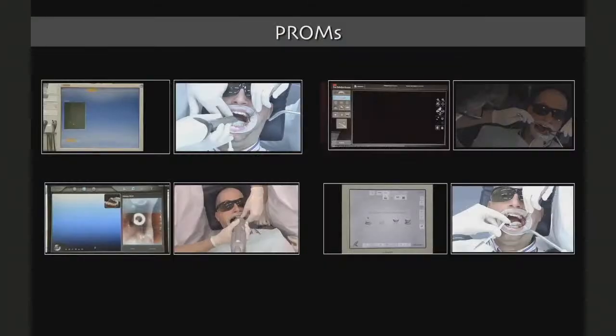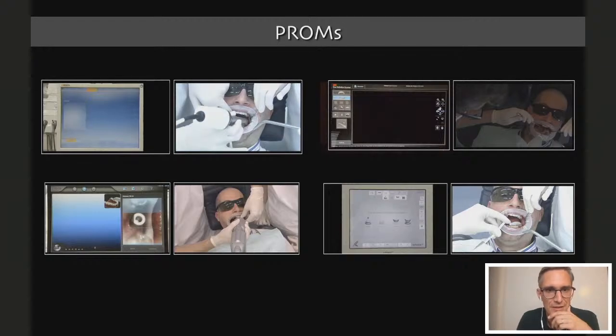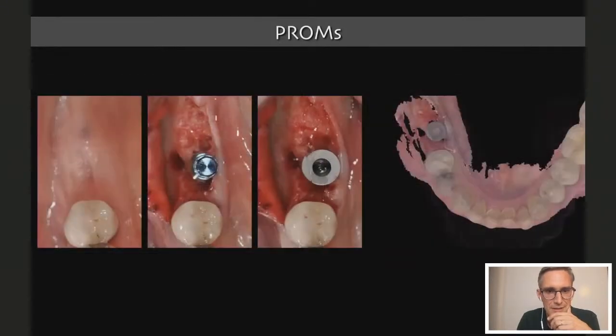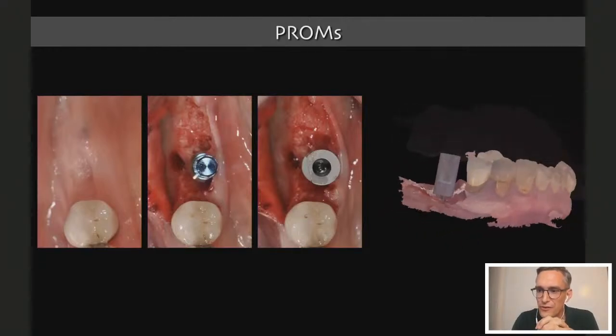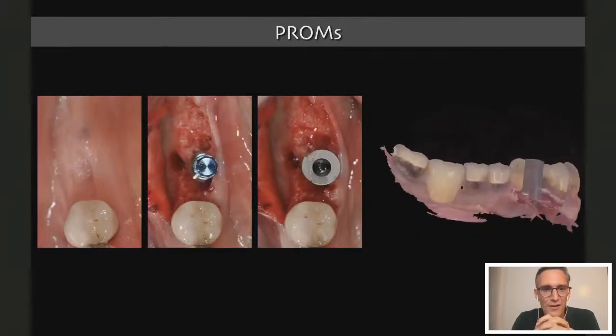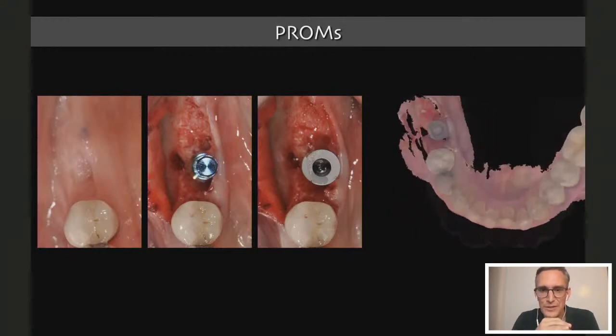Yes. We're with you. So what is important is also the patient-reported outcome measures, and they become more important. What we did is ask the patients what kind of impression they prefer, and all the patients in a study that we did actually preferred the intraoral scan.